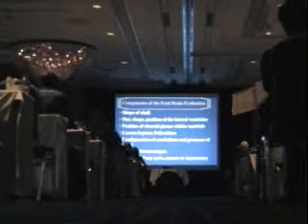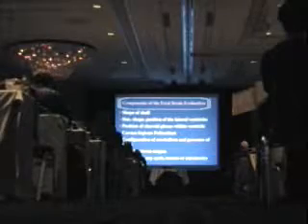You want to look at the posterior fossa, configuration of the cerebellum, make sure the vermis is formed, and make sure that there's plenty of space behind the cerebellum for the cisterna magna, but it's not too big either. It has to be less than 10. So you take a look at the size of the cisterna magna, and then of course you look at the texture of the brain, make sure there's no cysts or masses or anything that produces asymmetry or is abnormal.